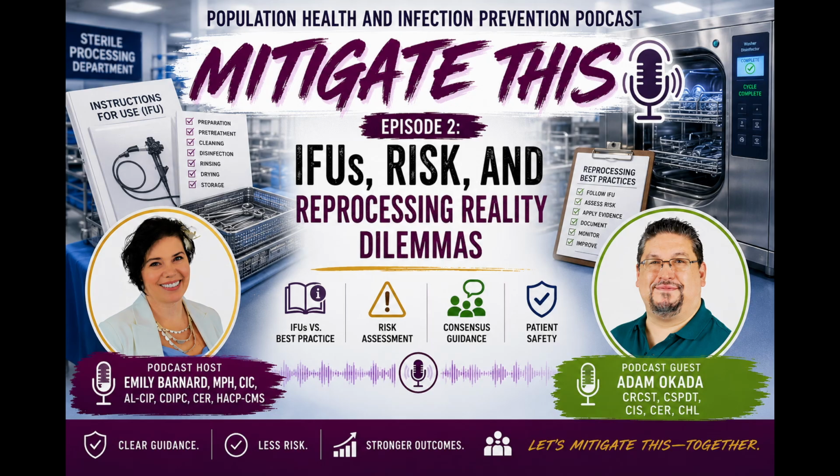Your general instruments, you're probably not going to need them, but just know, and this is something I point out in my IFU talk also, there's a manufacturer like Snowden Pencer that has a very specific way for rinsing the instruments, whereas another company like CareFusion might have a different way of doing it. And if you've got all these instruments mixed together in a set, you've got to sort of resolve conflicts in the IFU, and that is very troublesome and problematic.